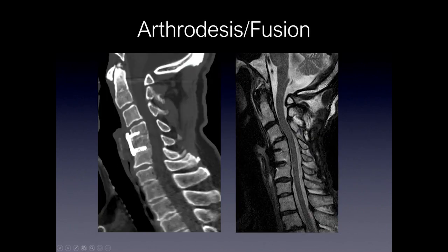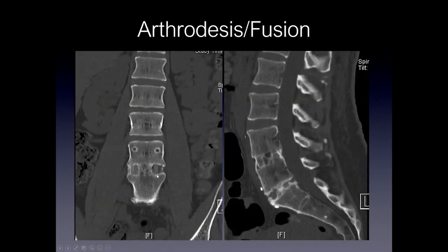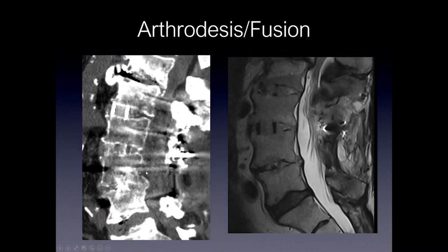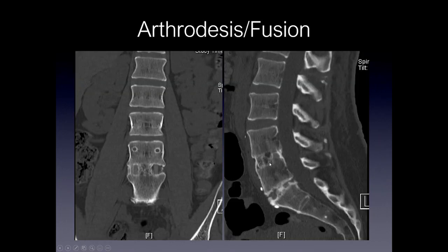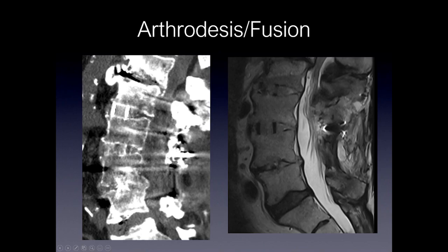Here are some examples of arthrodesis or fusion. You can see clearly that there's bony bridging across the disc space in this example. On the MRI, you can see continuity of the marrow signal between the two vertebral bodies. Here's another example — there is an interbody cage, and through the center of the cage and laterally there's clear bony fusion, as seen on the sagittal image. On this CT and MRI, you can see bony density across the disc space, and on the MRI there's obscuration of the margin between the cortex and bone graft material, with continuity of marrow signal between the two vertebrae suggesting fusion.